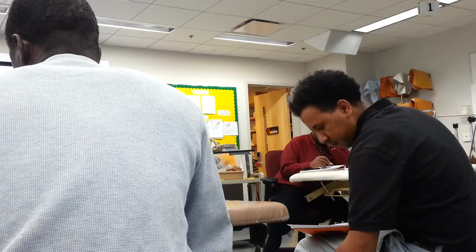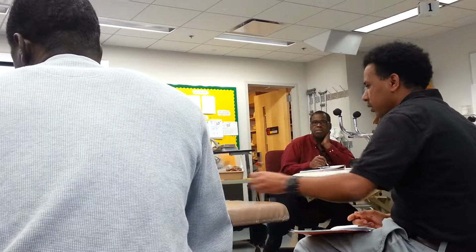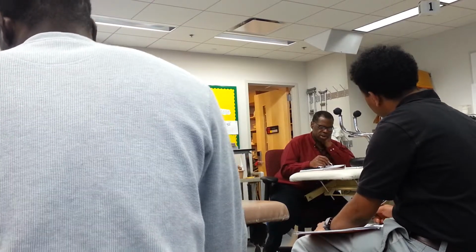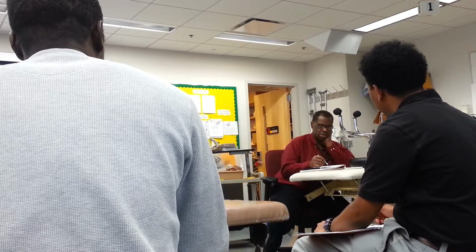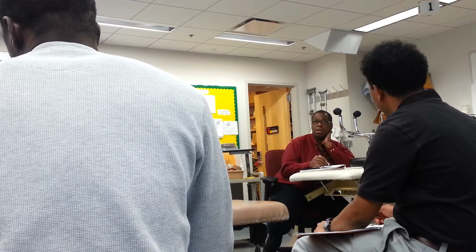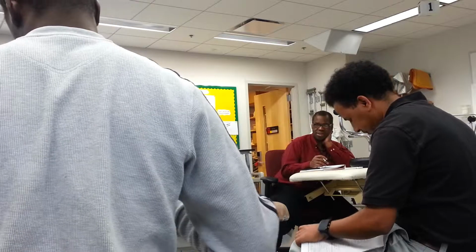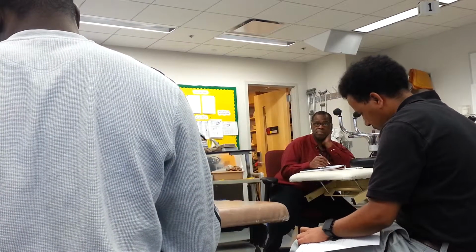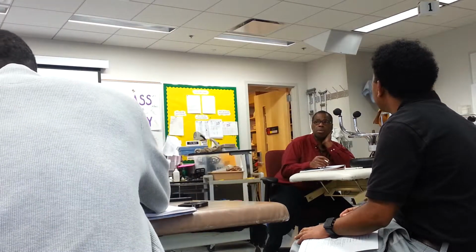Okay. What would be the intensity that I would want for acute pain? Sensory. And then the pulse rate. Pulse rate for acute pain. Now remember, I want tingling. 100. I want a buzz. And then the pulse width. Do I want a high pulse width because I want movement, or do I want a low pulse width? Like 80?